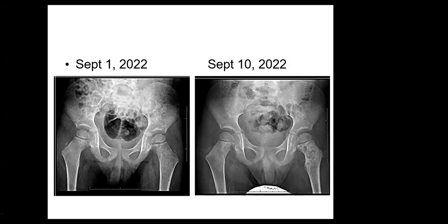So we're dealing with the case either with septic arthritis or with osteomyelitis, even with eosinophilic granuloma or bone tumor. So we recommend further investigation and further assessment by MRI.